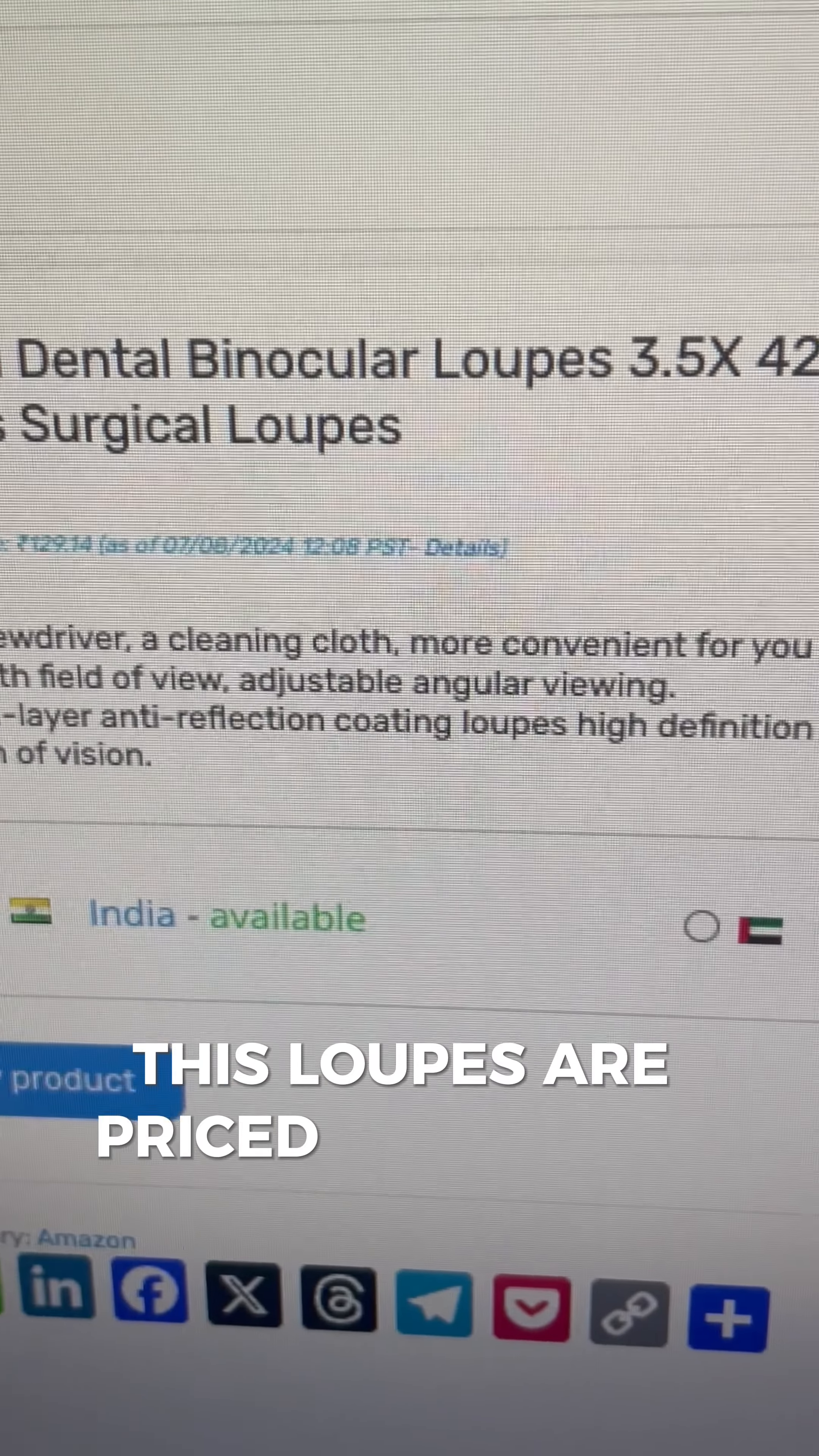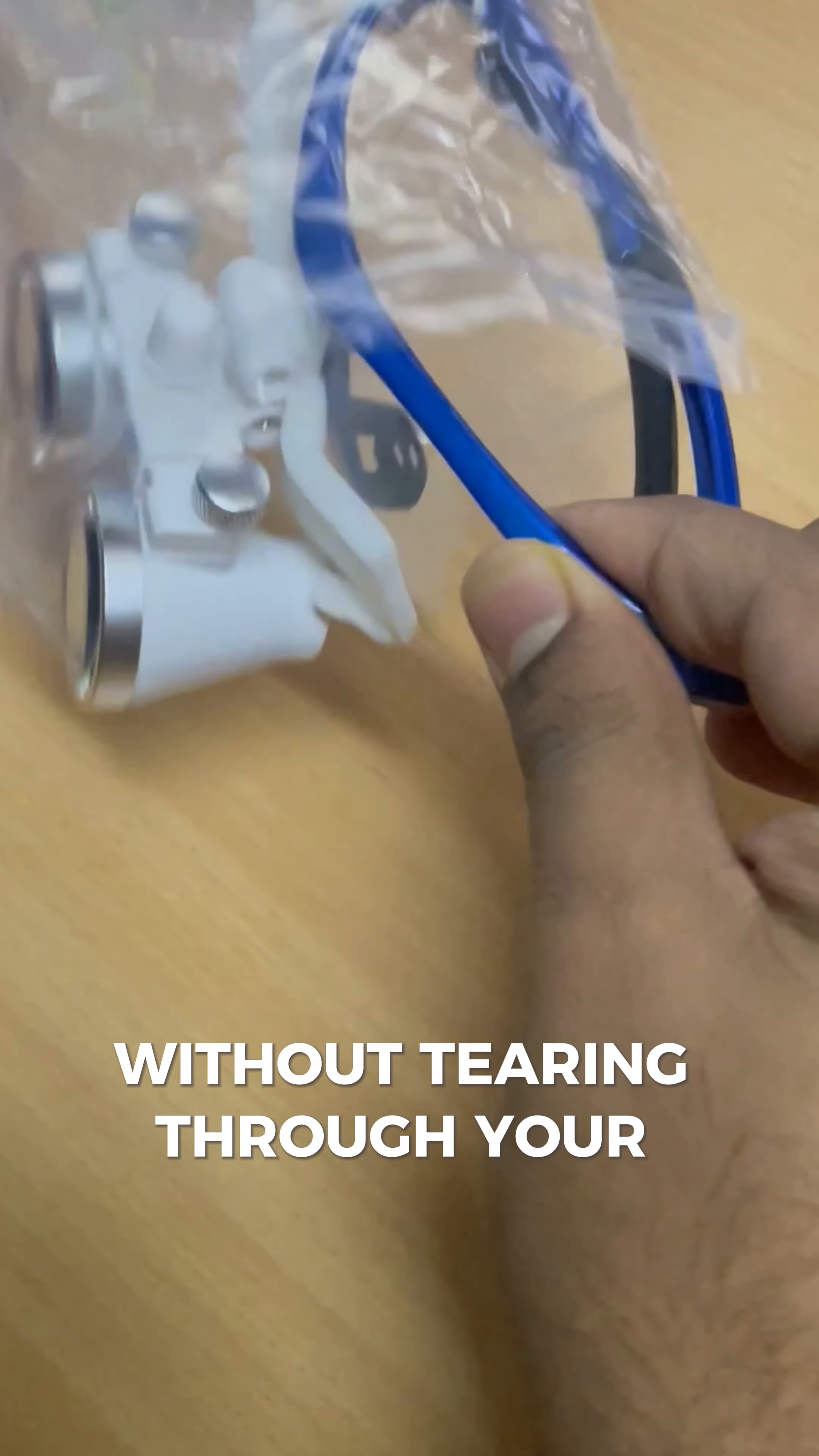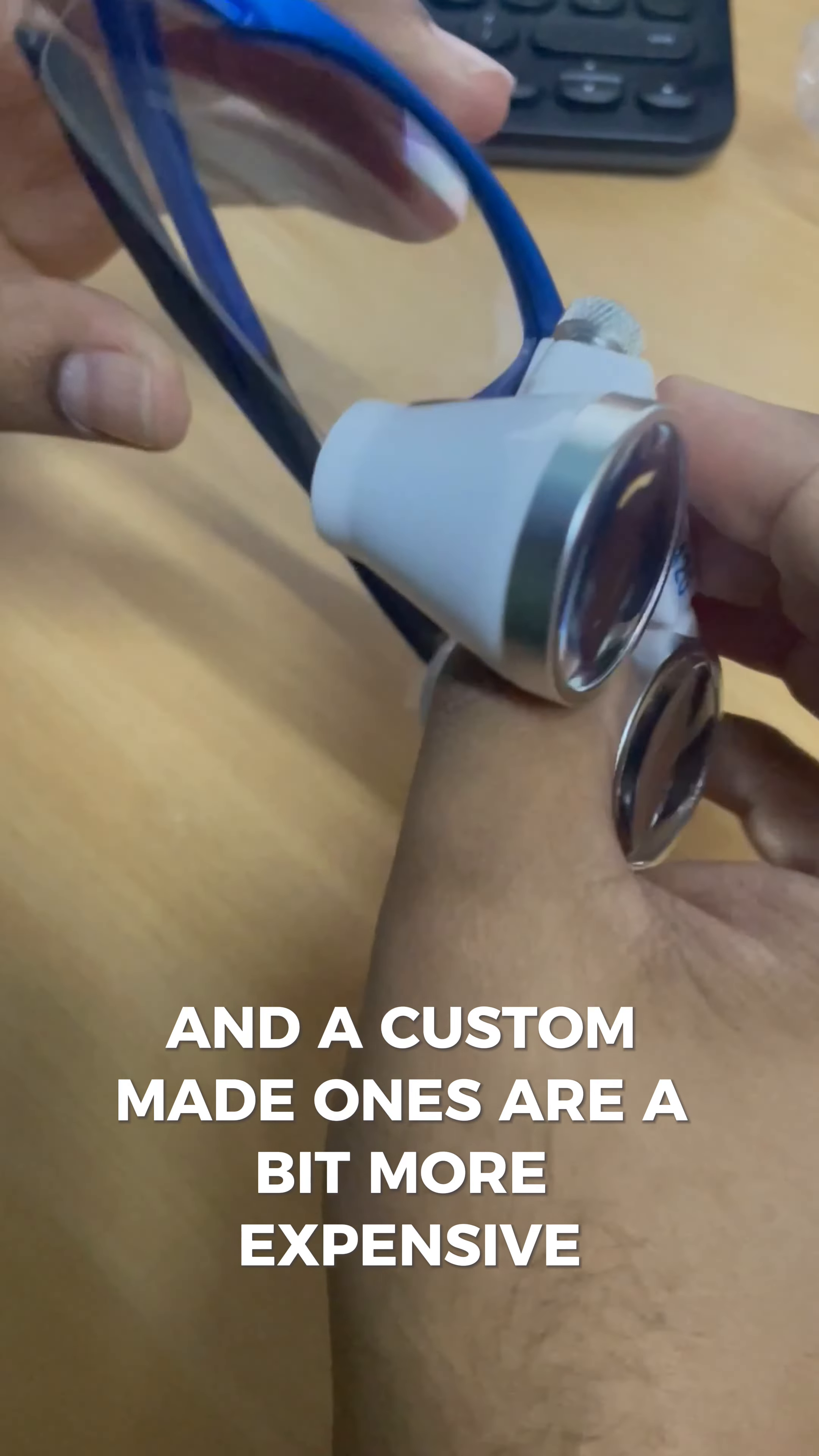These loupes are priced under 4000 rupees or approximately 200 dirhams in the UAE, making them the best option to explore without tearing through your pocket. A good quality brand usually starts around 1000 dirhams or 20000 rupees and the custom made ones are a bit more expensive.